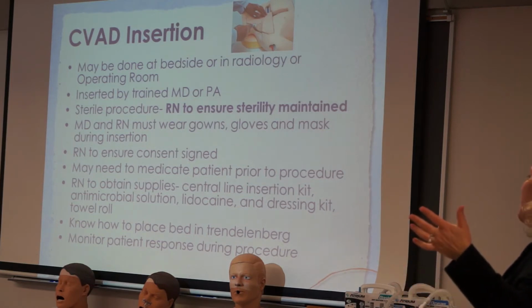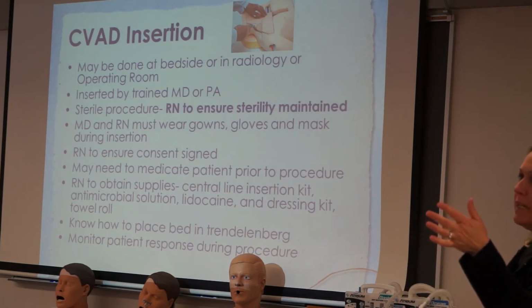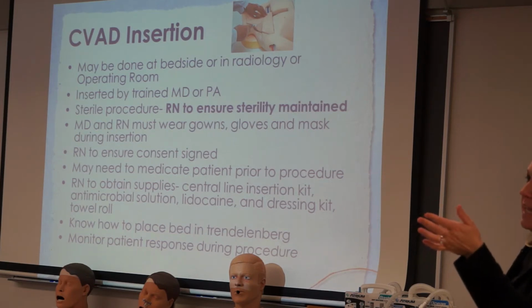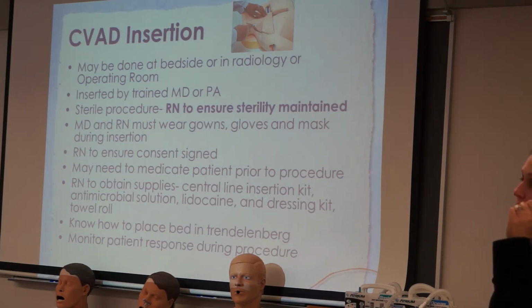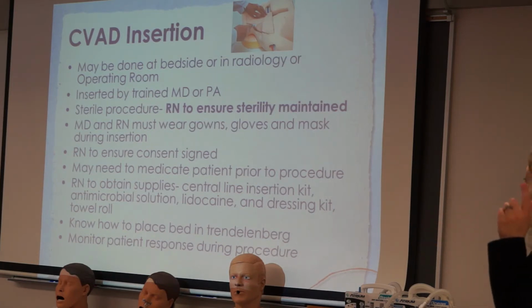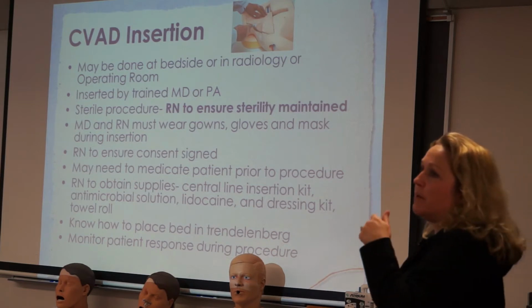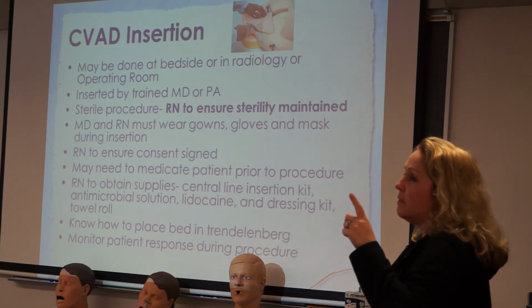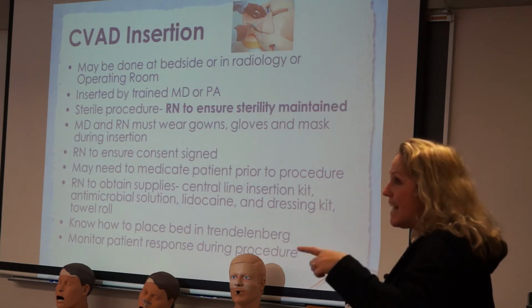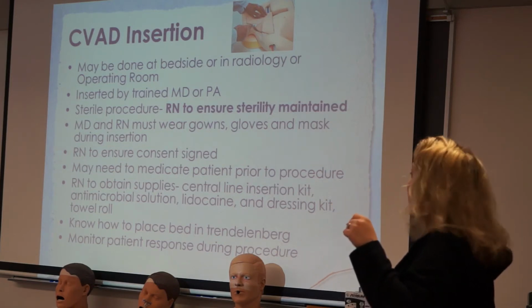Consents, you don't need a consent for PICC lines anymore. You'll have to find out from your facility whether you need a consent form for a central line. It may vary from facility to facility. What you do need, though, is a doctor's order. So before you call a nurse like myself to put a midline in, before you call IR to have a PICC line put in, make sure you have a doctor's order. I mean, you don't need a consent, but you do need an order, okay?